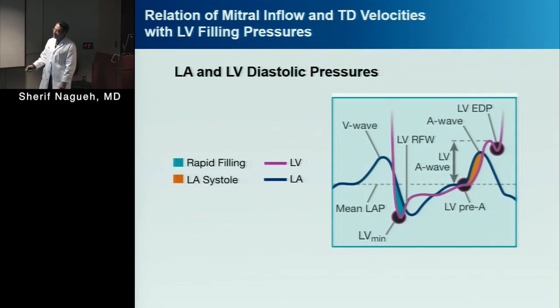So if you're doing a left heart cath, you do not need a high fidelity pressure catheter to get these signals. And certainly if you're doing a PA catheter, you are not using high fidelity pressure signals, and we use wedge pressure. The wedge pressure is very close to the LAP, but if you want to be more meticulous, there are differences between them, particularly in patients with mitral valve disease.